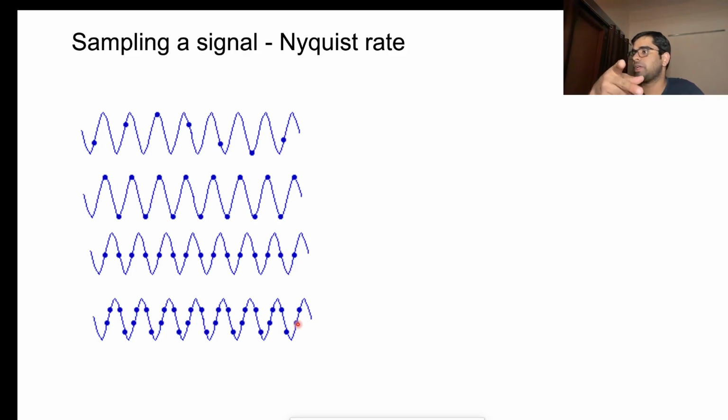If you're sending 2000 samples and can still reconstruct the signal, I can send 5000 samples and still reconstruct a perfect signal, but the cost I'm paying is the memory or resources required to transmit those 5000 samples versus 2000 samples. So yes, you get an even better signal if you send more samples.